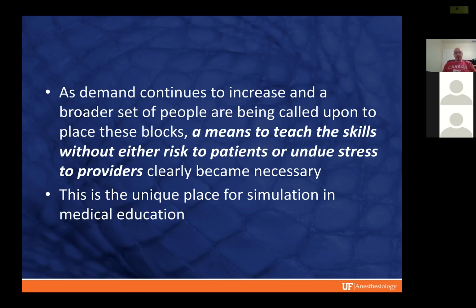And this is sort of a unique system in medical education. While simulators are not unique, the vast majority of simulators that exist are diagnostic simulators. So for instance, one of the earlier electronic simulators was a tool called Harvey that essentially generates artificial heart sounds.